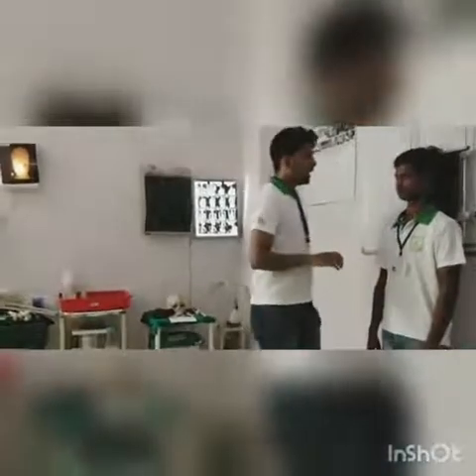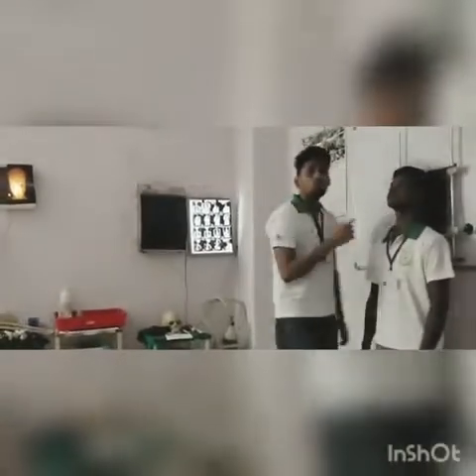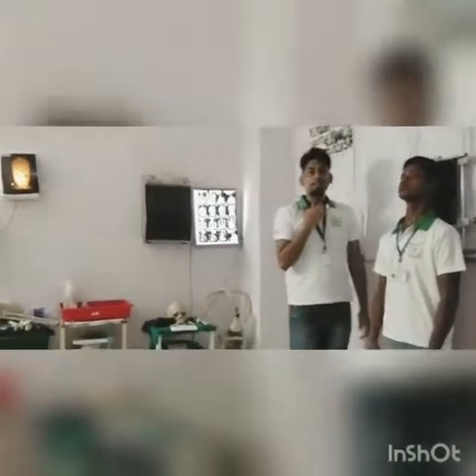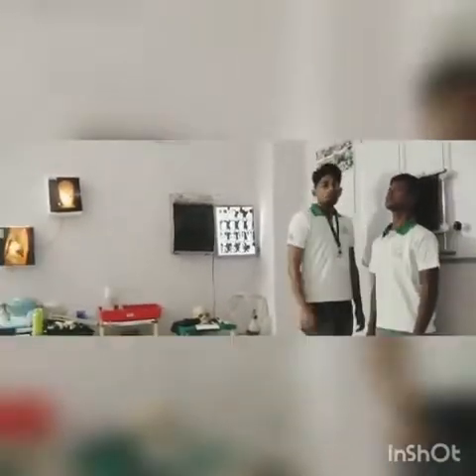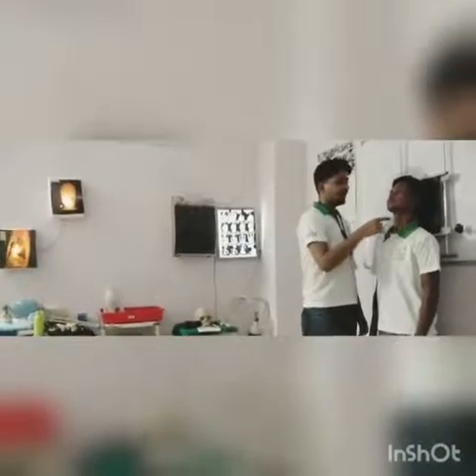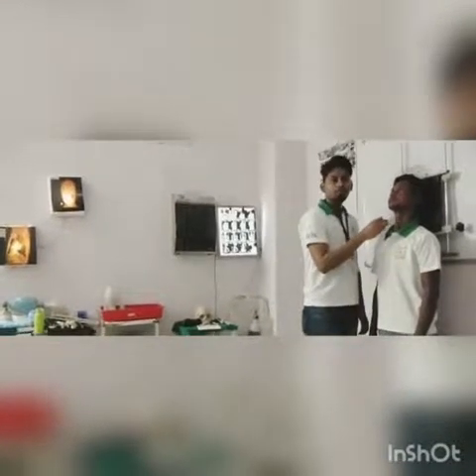Now I will ask the patient to stand in front of the cassette and raise his chin up, so that the chin doesn't superimpose on the cervical spine and we will get a clear view of the cervical spine. Now we will center at C4 and give him the exposure.